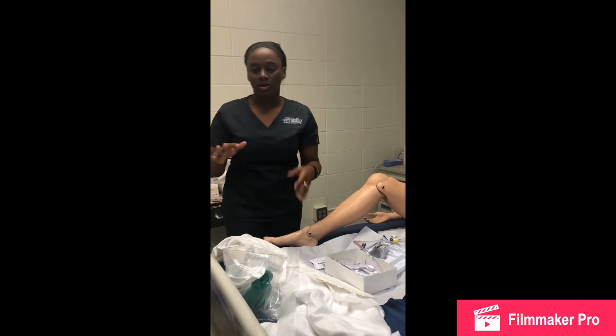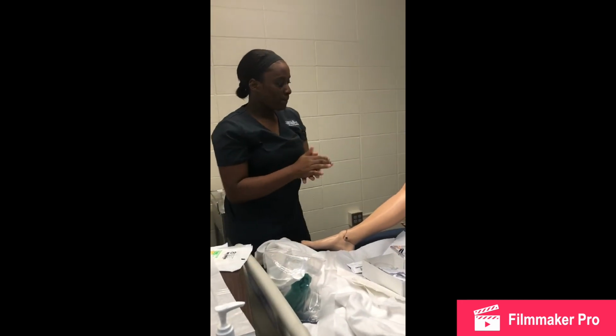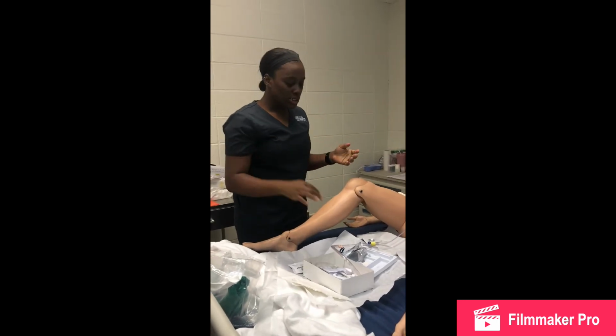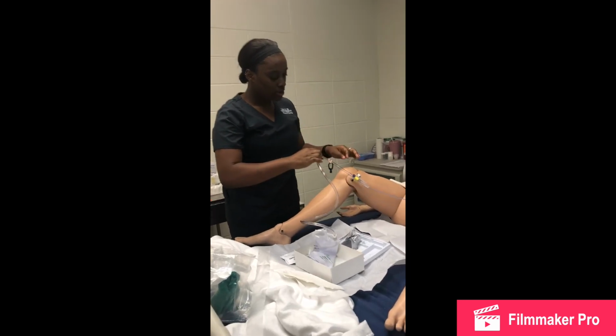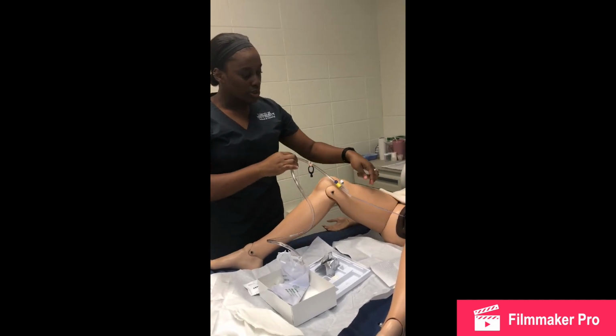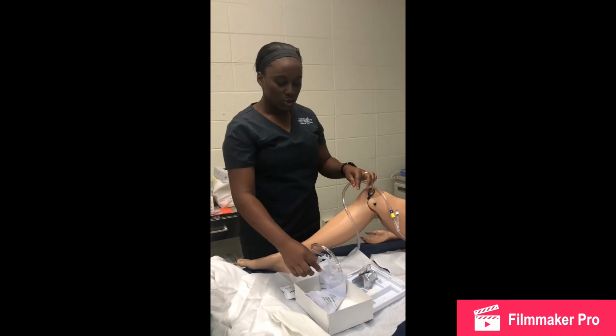Once I take my sterile gloves off, I'll then wash my hands. And in some hospital settings, they require us to tape this part onto the patient's leg, not being too tight but loosely. But for this video's purpose, we're not going to do that.